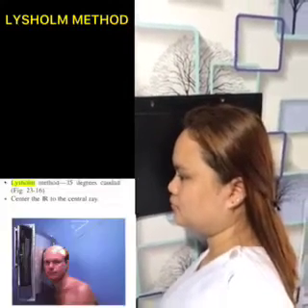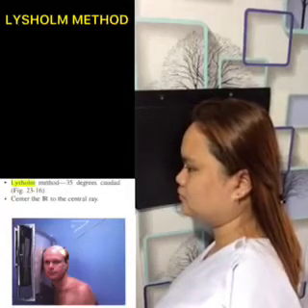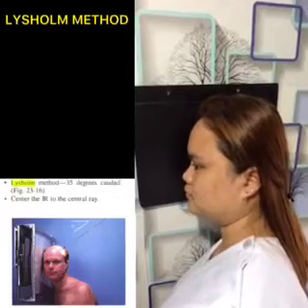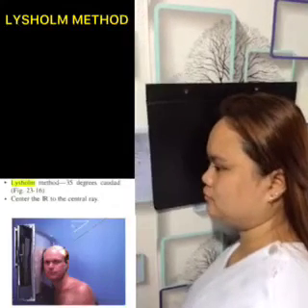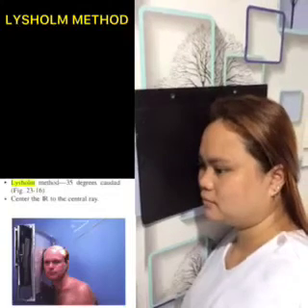Runström recommended that the exposures be made with the mouth open for visualization of the petrous apex between the anterior wall of the external acoustic meatus and the mandibular condyle.